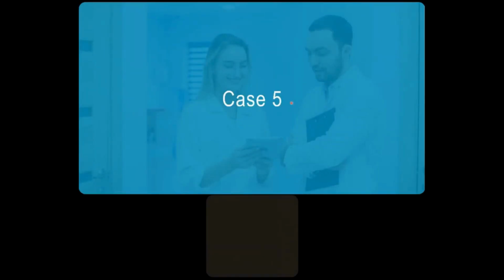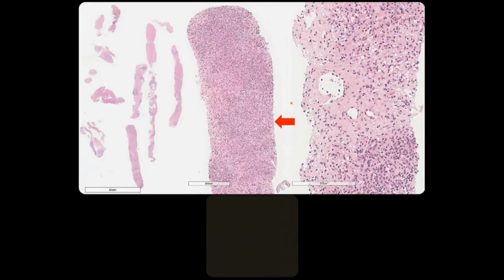Moving on to the fifth pattern. Case 5 is a middle-aged man who presented with jaundice, nausea, and malaise. He had preceding sore throat and fever and had been taking an undisclosed amount of Tylenol. His laboratory results showed AST and ALT of nearly 6,000, with bilirubin of over 200 and an INR above 10. The imaging revealed abnormal liver morphology, and the possibility of decompensated cirrhosis was queried, and a transjugular liver biopsy was performed, as you can see here, for further evaluation.